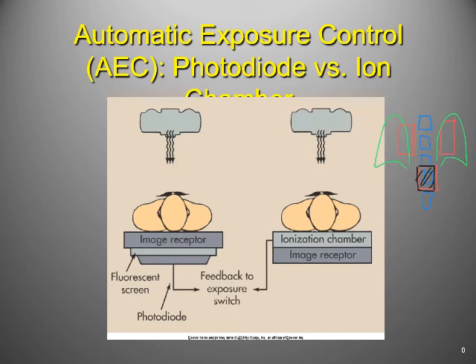So what's going to be the problem if I'm looking at a chest x-ray and the exposure level was sufficient to get through the thoracic spine? How's that picture going to look? Yeah, if we were talking about film, that would be completely burned out, right? Like black like that stuff over there, right? So I have to be very aware of what ion chamber on this triad pattern I've energized, because that's how it's going to measure the exposure.